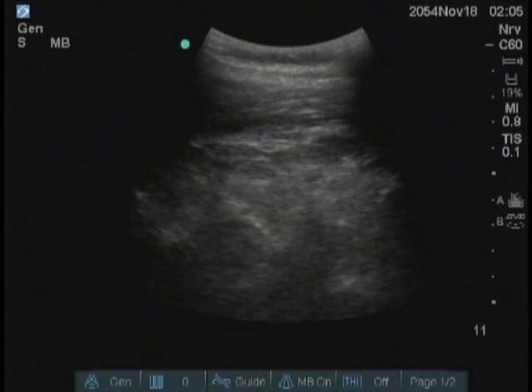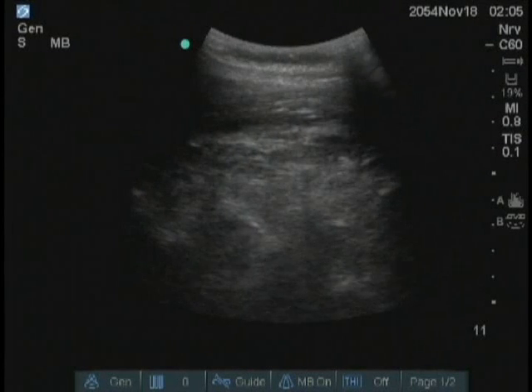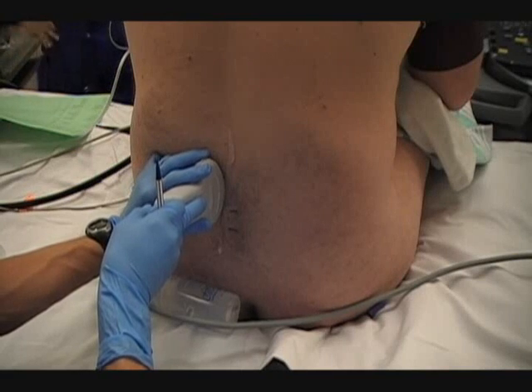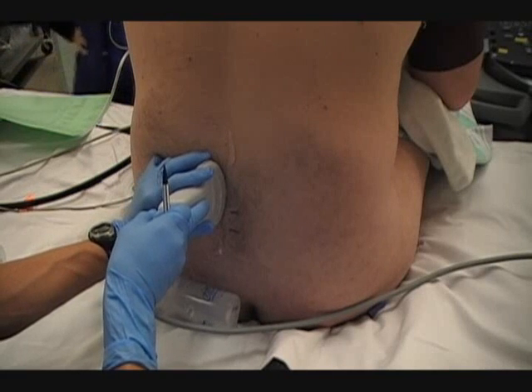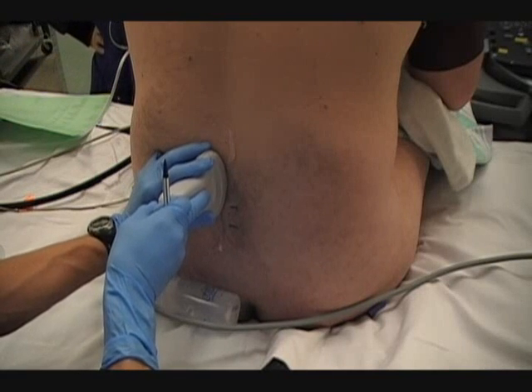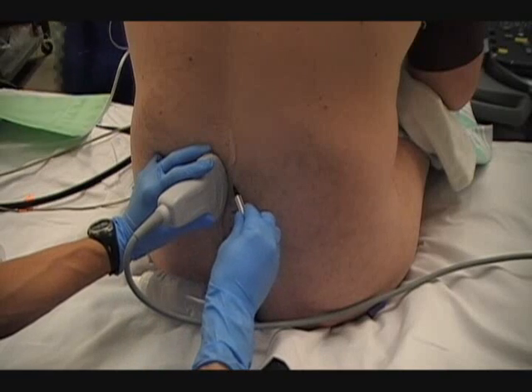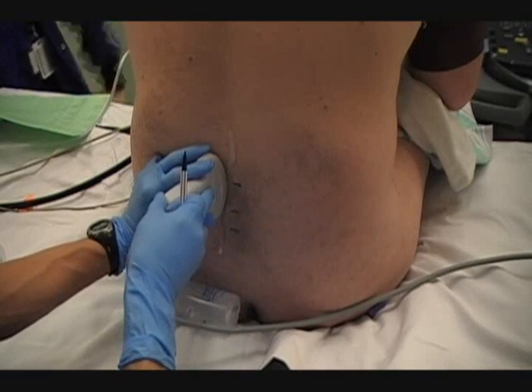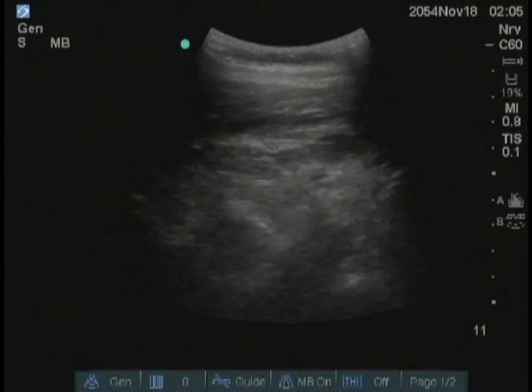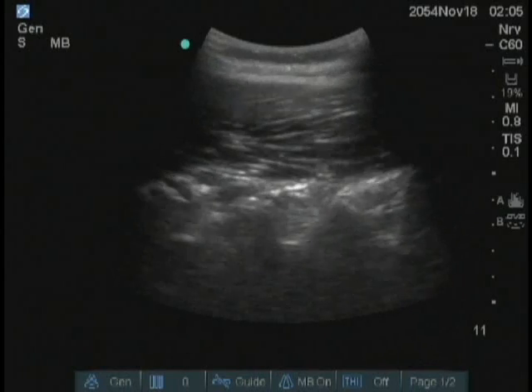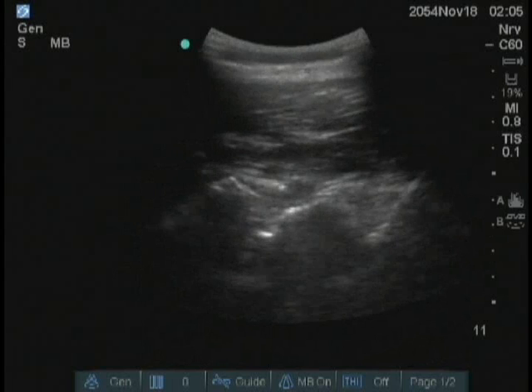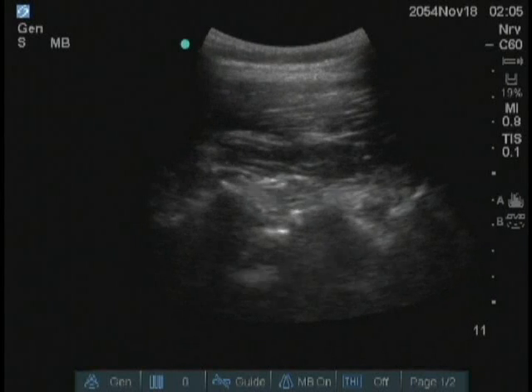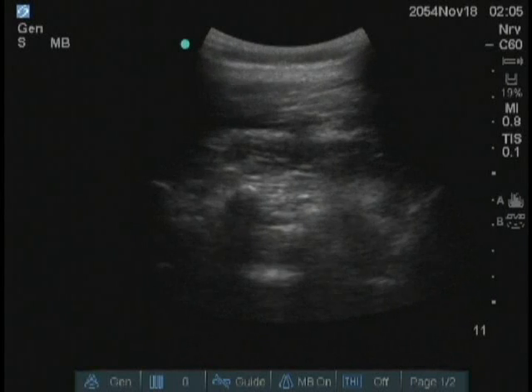These marks serve as useful reference points when scanning in the transverse orientation later on. Note that if there is a large amount of gel on the skin, it should be wiped clear before marking the area.